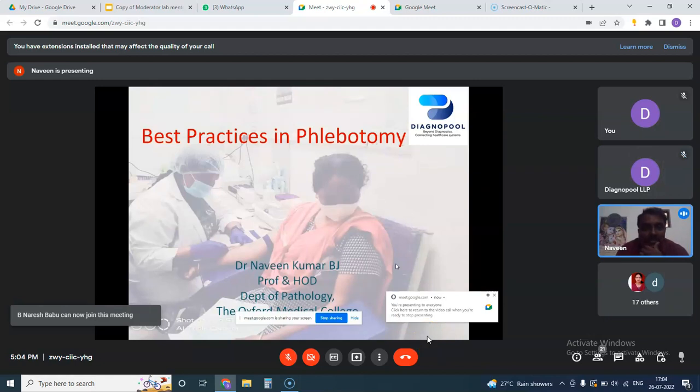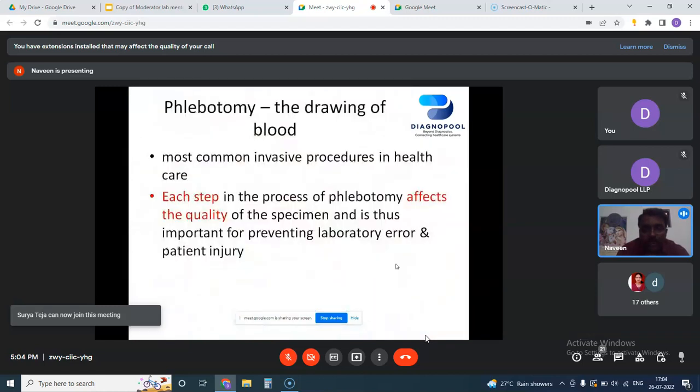So, let's start the session on best practices in phlebotomy. Good evening, everyone. Welcome to the session. Phlebotomy, as all of you know, is drawing of blood and is the most common invasive procedure in healthcare. So, each step in phlebotomy can affect the quality of specimen.